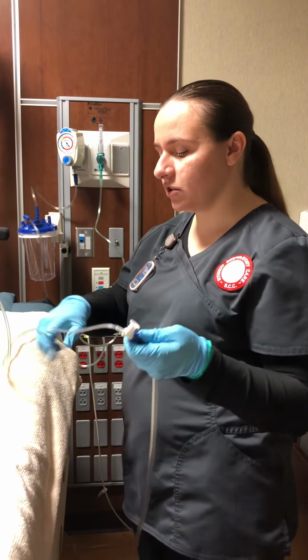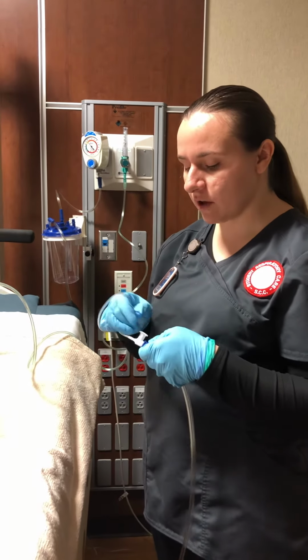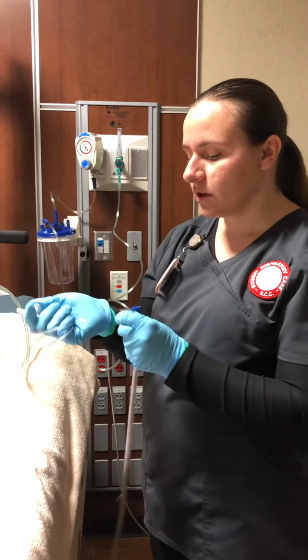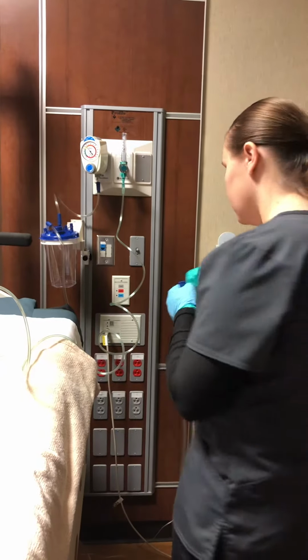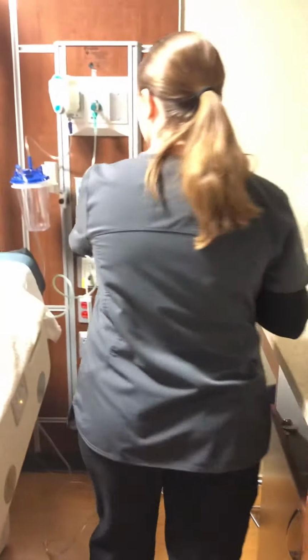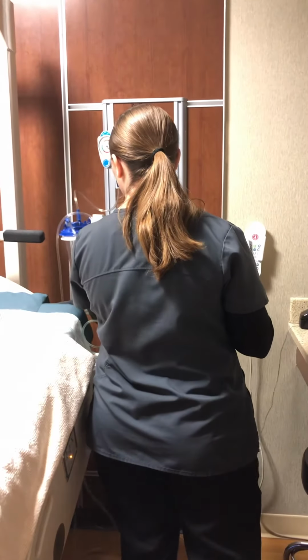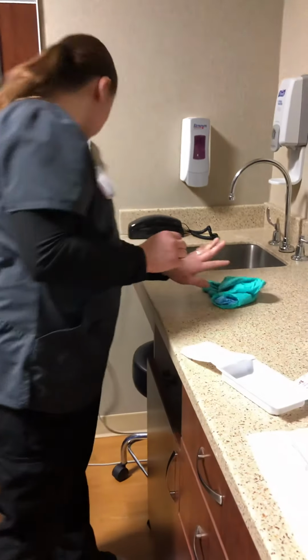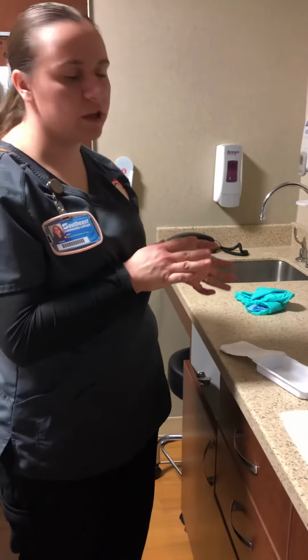And so when we are finished, we'll wrap it. You can wrap it around your glove, place your hand on the suction catheter, then you can remove it with your glove like that. Dispose of it. And you can place your tubing over here if you need to use it again. And then you will remove your PPE. And then you will always wash your hands after you remove any gloves.